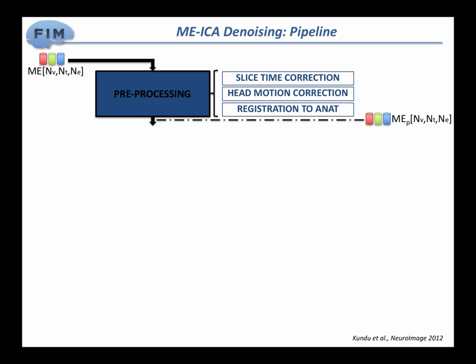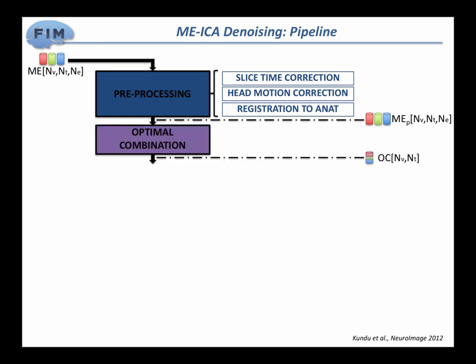I would argue maybe you don't want to do filtering, because that would allow you, when you're looking at your components, to really see whether some of them have high frequency, and if you have cut it before, that might not be that easy. You might want to do your registration and do all this business either in a final MNI space or on the original space, pick your poison. Then you're going to do the optimal combination.